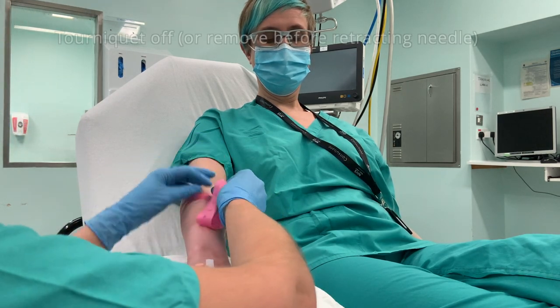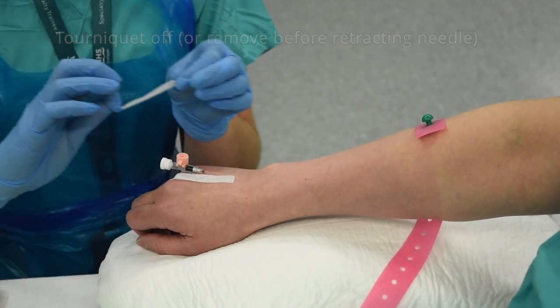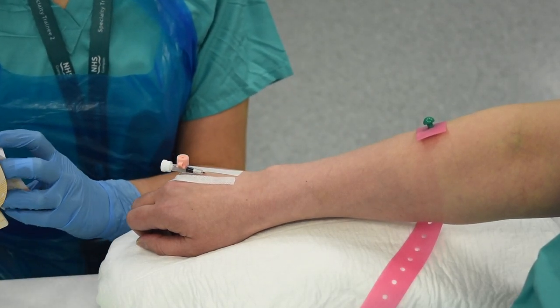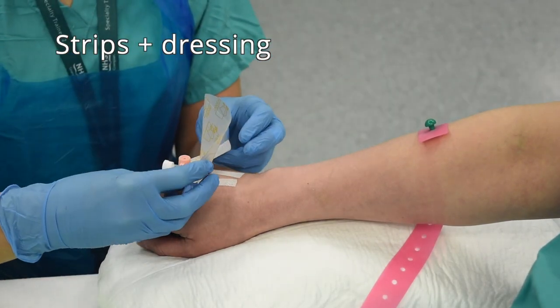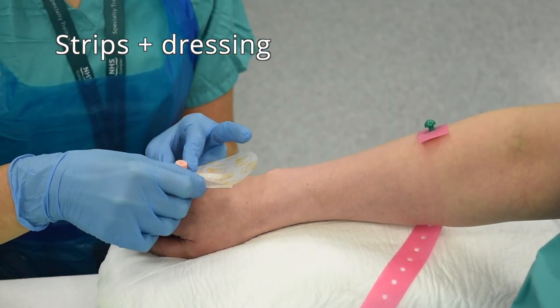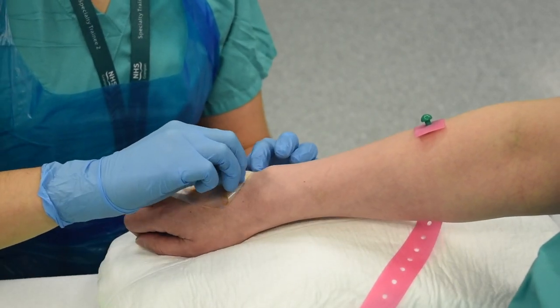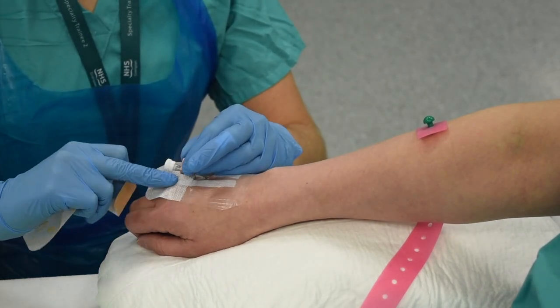Remove the tourniquet — it's a good idea to do this before fully retracting the needle if you're not used to how much pressure it takes to fully occlude a vein. Dress the Venflon with sterile strips going across the wings to keep everything in a straight line, and apply the dressing covering the insertion site right up to the hub of the injection port.